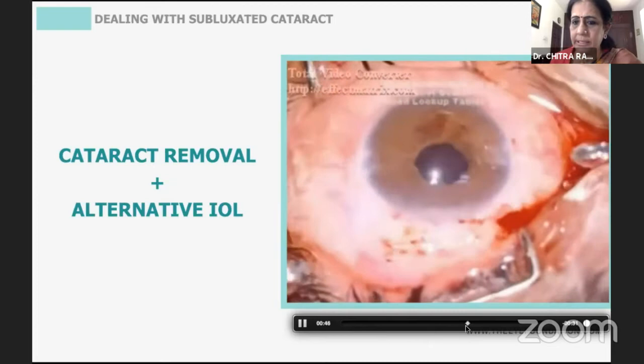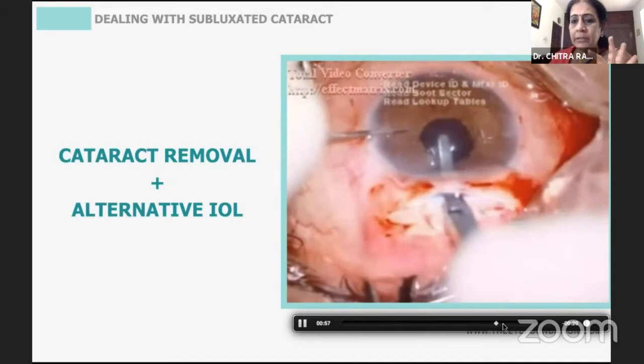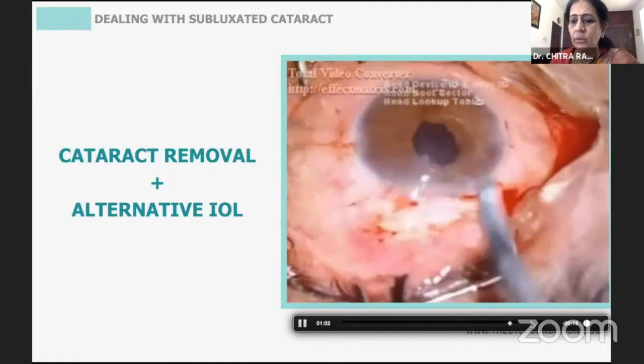And there is no need of putting a pilocarpine in these eyes, but I would place an iris clip lens as the easiest approach. And I've made my 3 o'clock, 9 o'clock incision. I stabilize the iris clip, place it behind the iris, and just tuck the iris tissue into the haptic, and do it on both sides and get done with it.